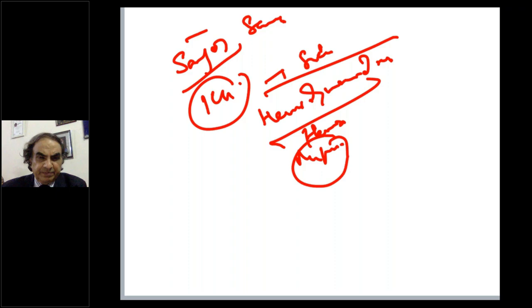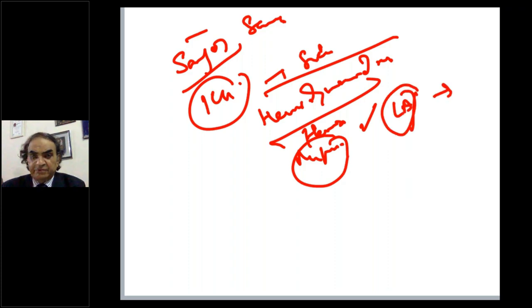The patients are critically ill, so can these patients take up DL? Only if the patient is hemodynamically stable. If unstable, there's no role. You should not do it. That's the answer. You can do it under local anesthesia, but then you need to have some pressure inside, so keep very low pressure. Very rarely you can do that, but it's not indicated. Then you don't need to.